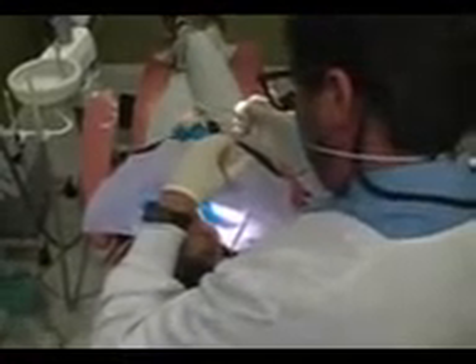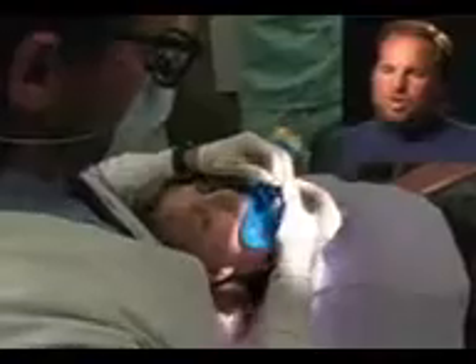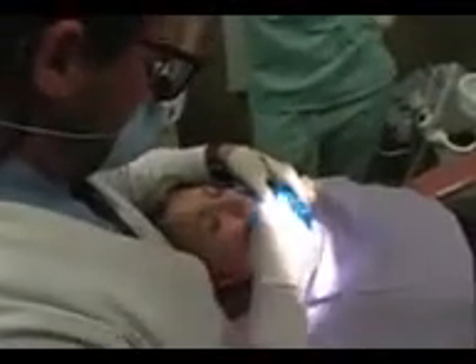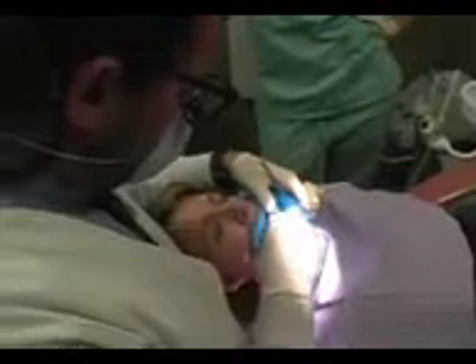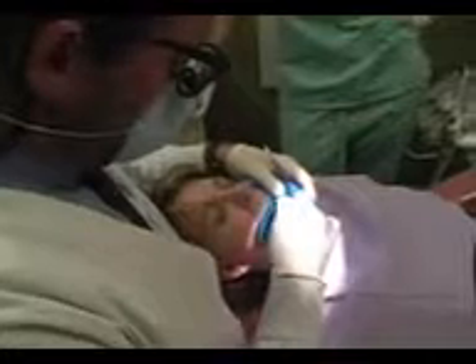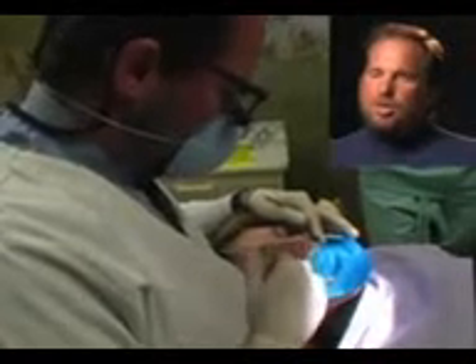We still use our hand files — which you see me using here — to verify the length of the root during the procedure and also to keep things clean. We use a combination of both the rotary handpiece-driven files and the hand files. I'm using lubricant on the files to help clean and shape the root canal. I also put a little topical anesthetic on the file, which helps if any part of the tooth is sensitive — that numbs the tooth even more so the patient feels no pain during the procedure.